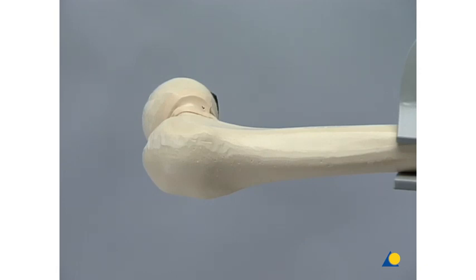A K wire is introduced anteriorly along the femoral neck in order to indicate the anti-version and overall direction of the planned screws.